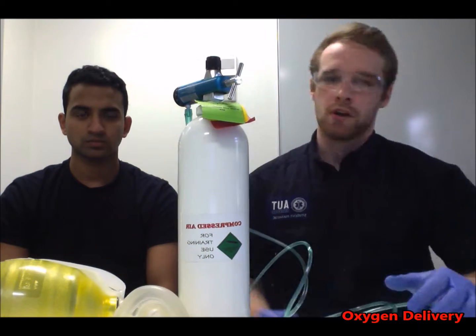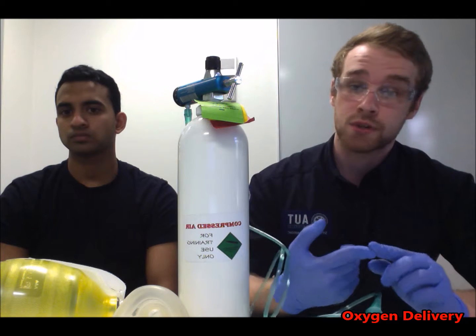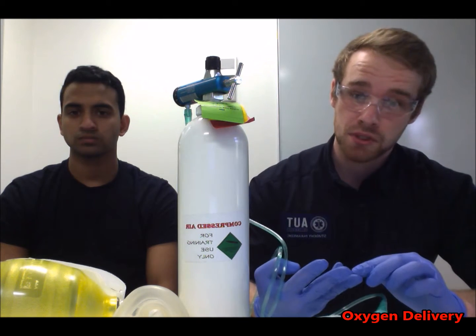So that's all working. Oxygen delivery is indicated for patients when they have a SpO2 of less than 94%, or they have an obstructed airway, respiratory distress, carbon monoxide poisoning, or even smoke inhalation.